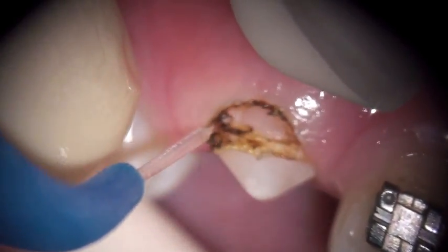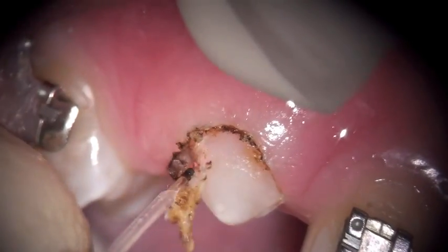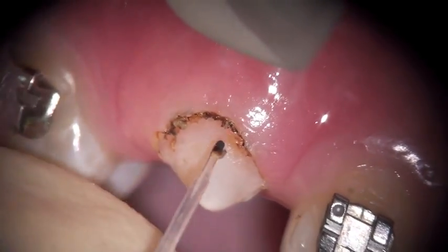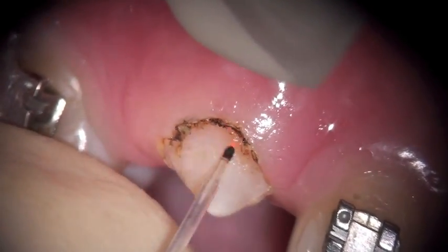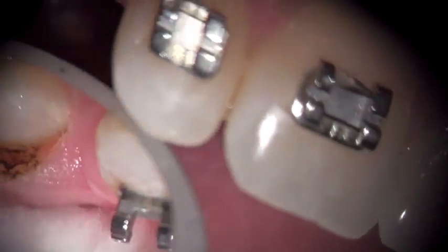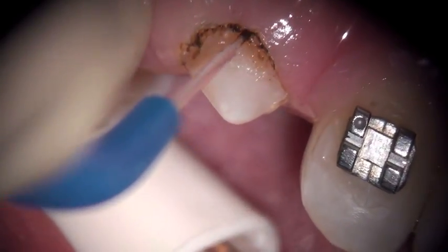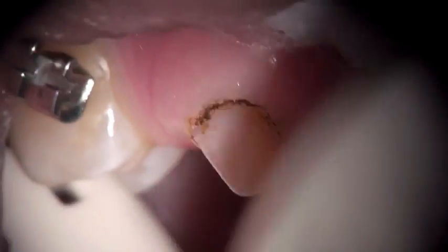Almost done. I can't see the thickness of the tissue that I was able to go through. Now I can get a brace on that too — it's going to be a little bit more. You've got to use a brace on that too, and then we'll hold it first.